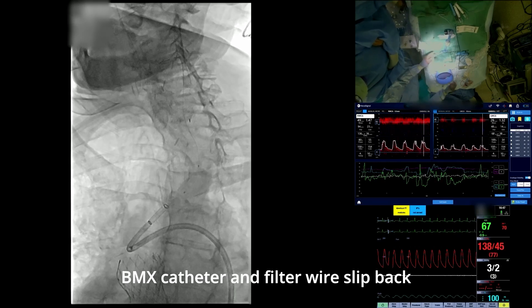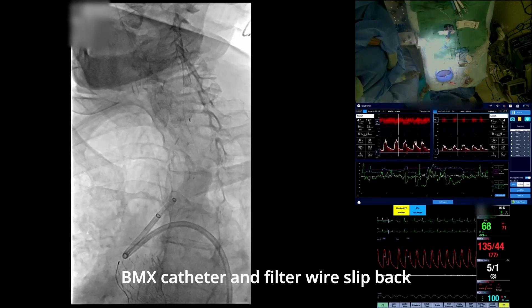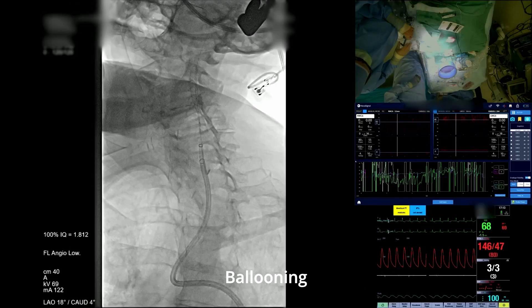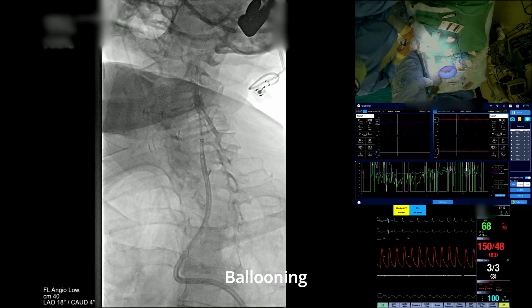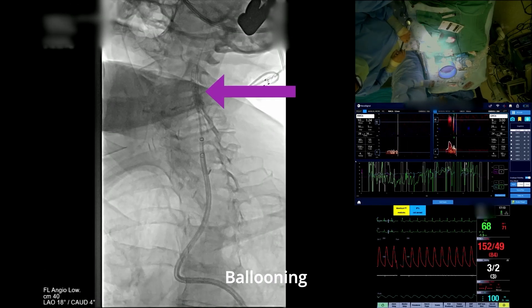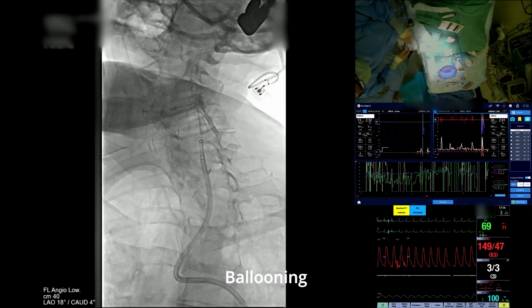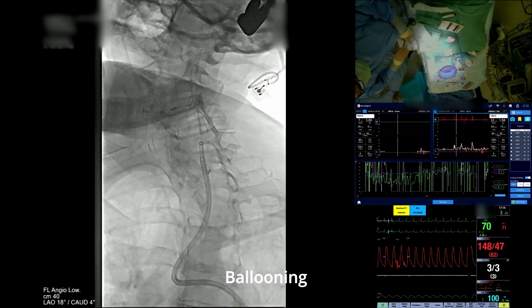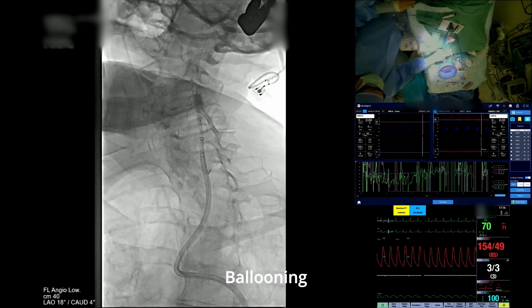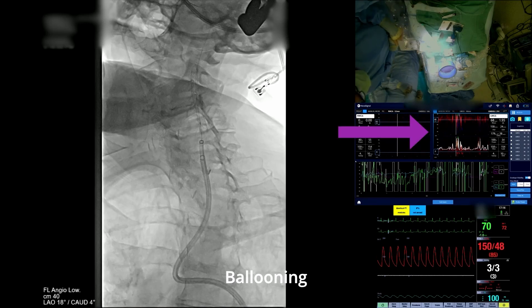The BMX catheter was then again advanced into the left CCA and the lesion site was ballooned. By this time, the TCD signal was unfortunately mostly lost due to ultrasound probe movement from the optimal bone window, but microemboli were still visible during ballooning as white hyperintensities.